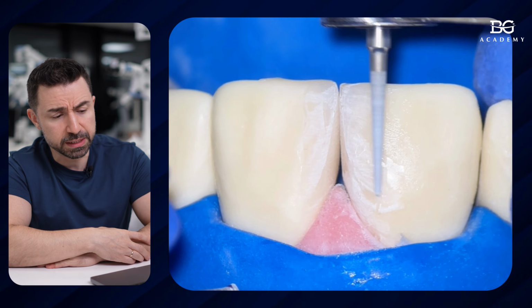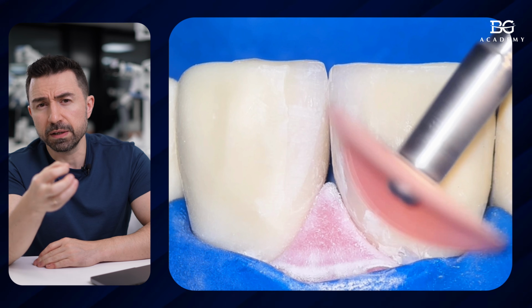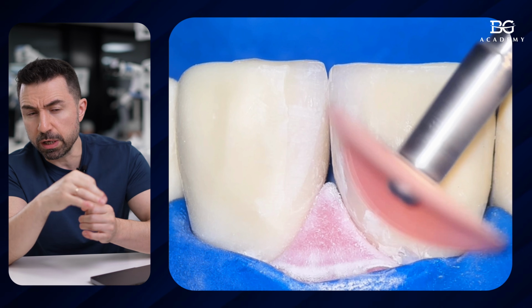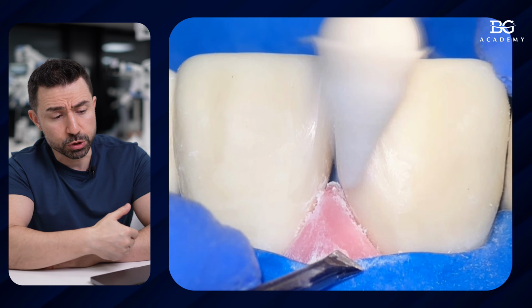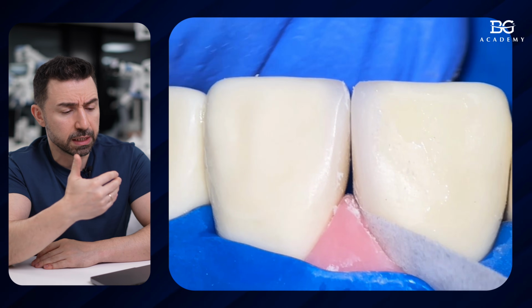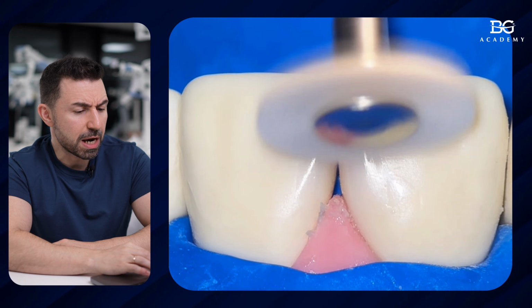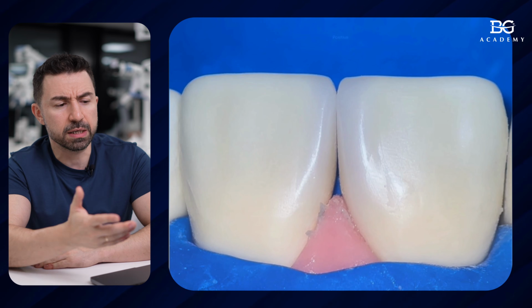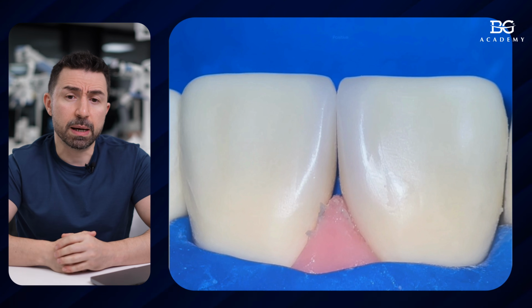There will be some overhangs in a cervical area which you can manage with a thin carbide bur, with a strip, with a scalpel blade, whatever, and then we just polish this contact as we usually do for composite restorations using different instruments like silicone points. Then we go with spirals, with the brushes, and so on. So then you get better interproximal contact, even if you made a mistake in the previous steps. I hope this technique will help you to make your restorations better, your interproximal profiles better.